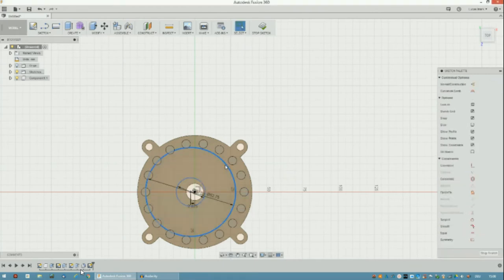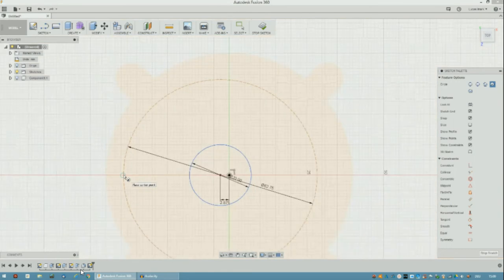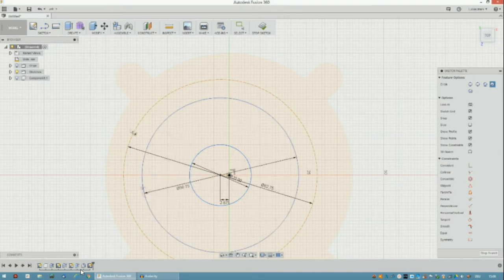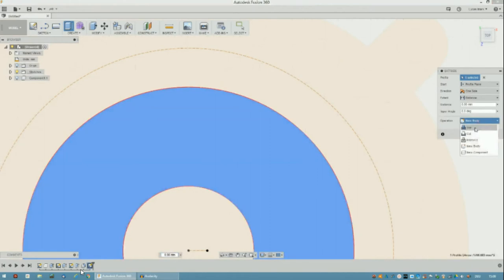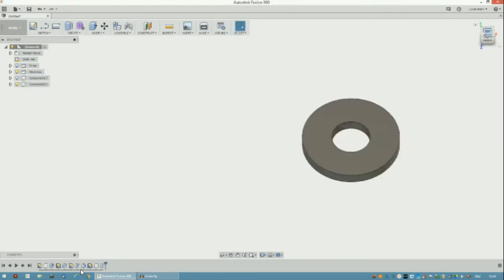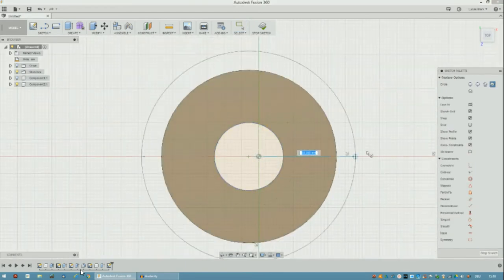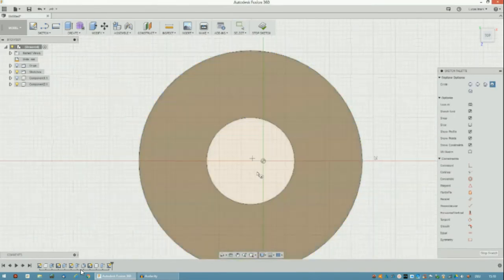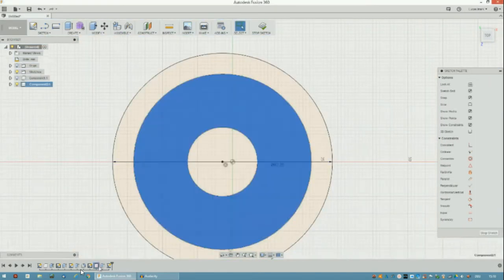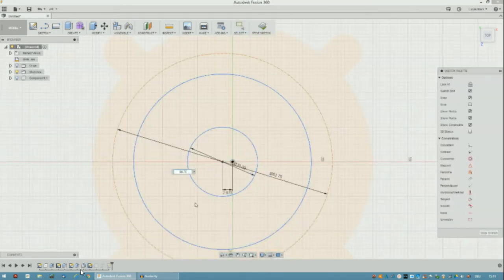And now I'm going to extrude that so that we have our new component, so that we don't have the old piece disturbing us in the background. By the way, I made the bigger diameter build line by hitting X on my keyboard. But the build line disappeared by extruding this part. So yeah, I draw it again, and I could have done this better. You're always learning, especially in CAD. So yeah, here we are, making it a build line. If you make it a build line and you extrude something, you don't extrude the build line, so it ignores the build line.